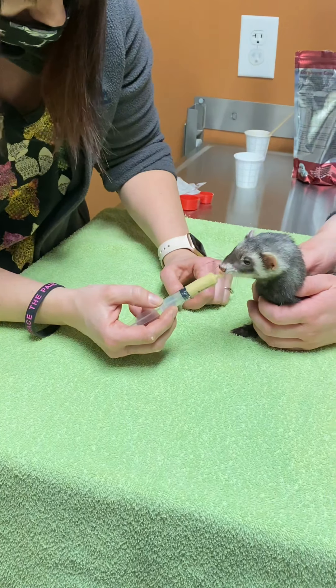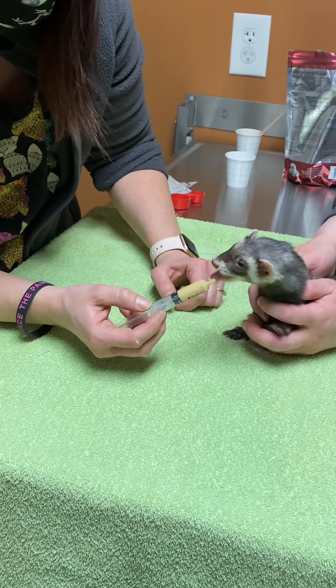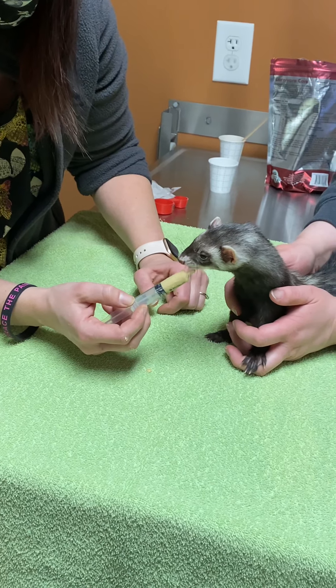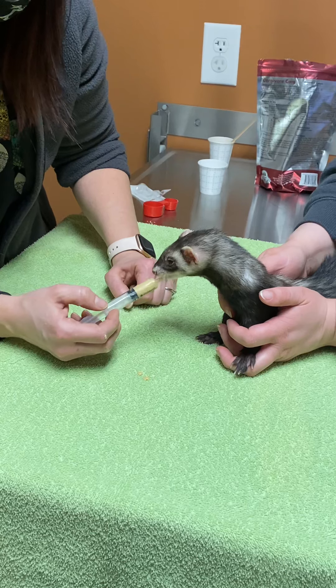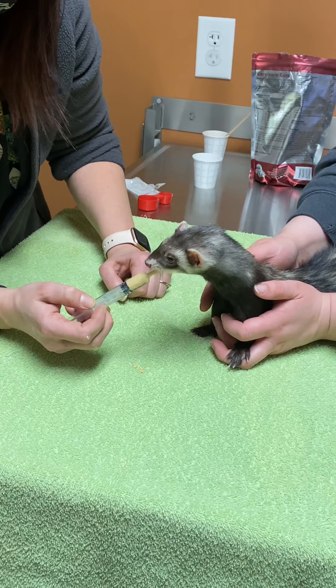She's definitely exploring it and she definitely likes it. She would be one of the patients that you wouldn't have to wrap up or do any extra handling to get her to eat this. She loves the flavor. She's sucking it up — she says that's so good.